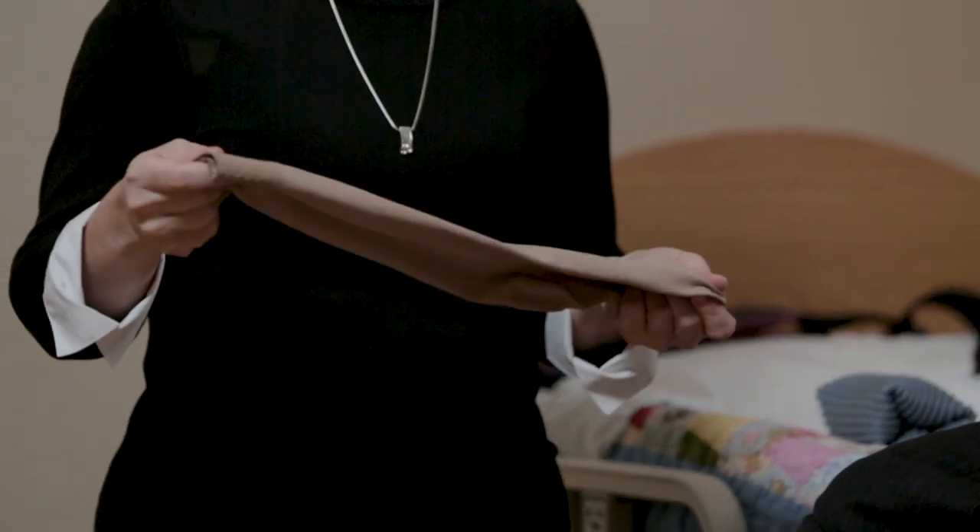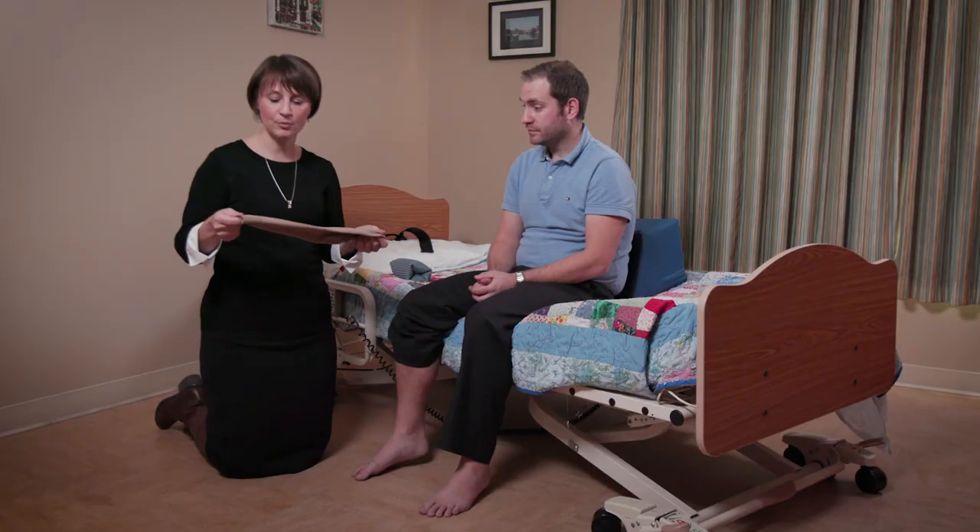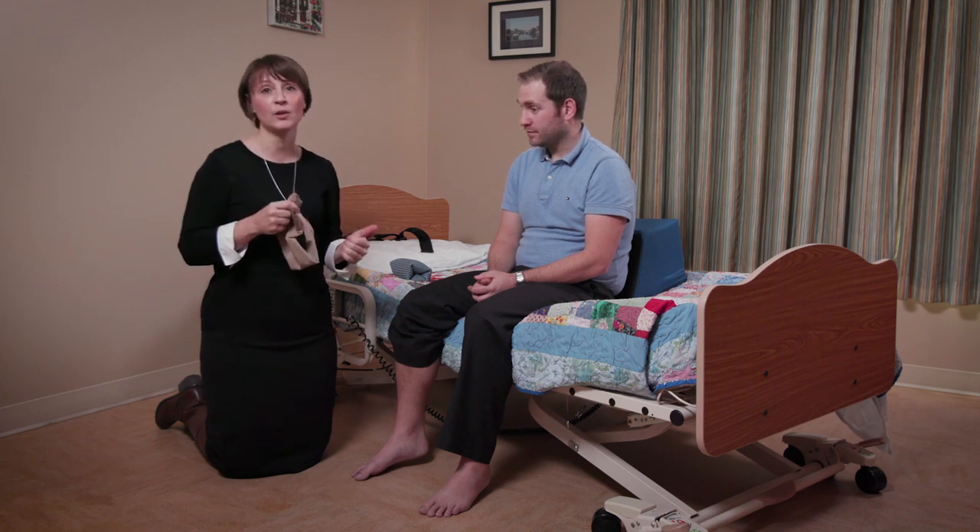One of our common tasks in home care is putting on compression stockings for our clients. They come in various sizes, colors, and lengths. Putting these compression stockings on — especially getting them over the heel — can sometimes require a lot of force, is often at an awkward posture, and because of that we do see some injuries.